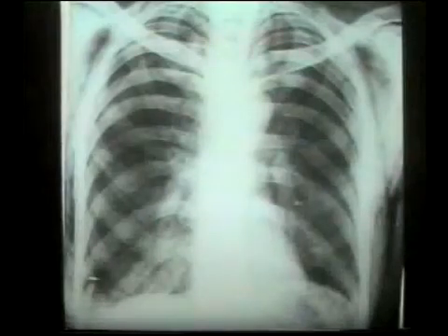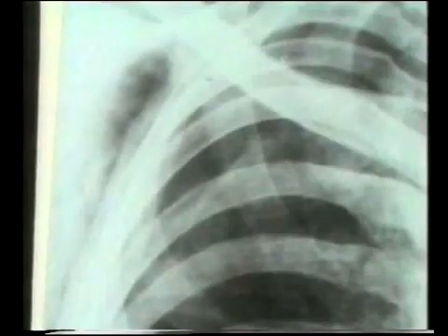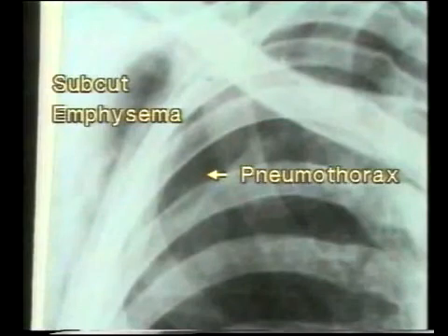This X-ray shows surgical emphysema, which results from a pleural tear secondary to rib fracture and leakage of air into the subcutaneous tissues. Note the fibers of pectoralis major that are so clearly lined by the air, and the air in the subcutaneous space surrounding the chest wall. A careful inspection shows a small pneumothorax and the border of the partially collapsed lung.